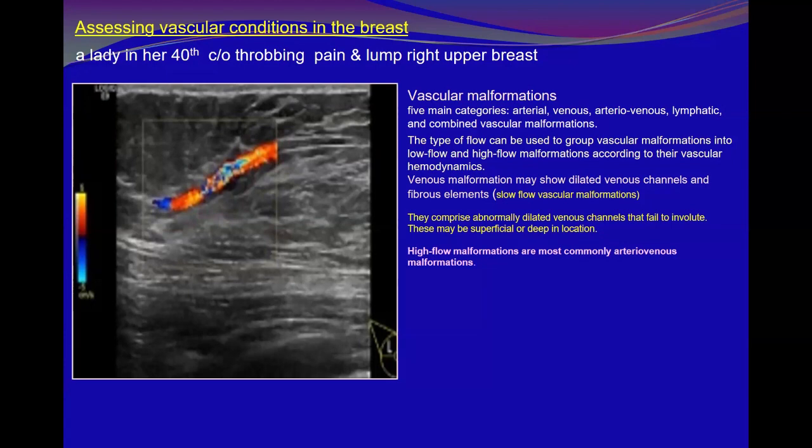When you go to near yellow or orange, this is higher. This is higher flow velocity than the red one. But if you reach the green one, this is very, very high flow velocity, extremely high. There is faint green at the periphery here. Very faint, yes.